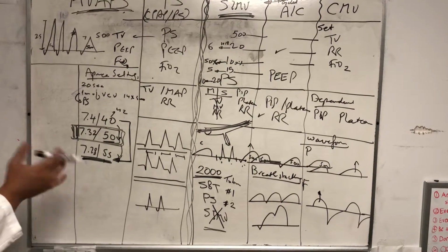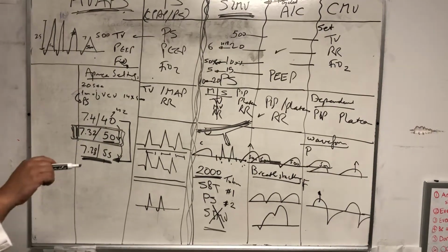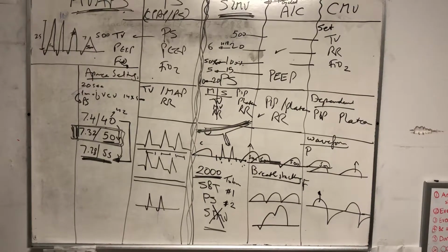What you do, you go with them in the room and you keep resetting the alarm. The alarm happens every 20 seconds. It happens before they give the breath, or the machine gives the breath. So reset 10 times or something, and then the patient will breathe. Okay? Yeah, it's fine. 10 times, it's still oxygenating. They're getting oxygen. So they're gonna build up CO2 until they breathe. Or you can squeeze the vent tubing if you want.